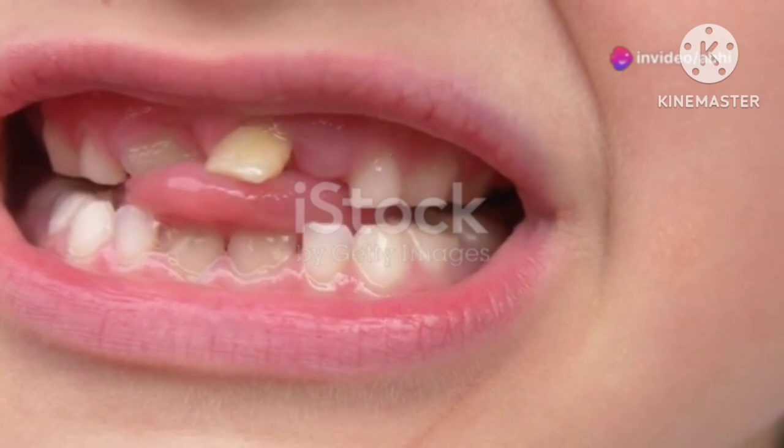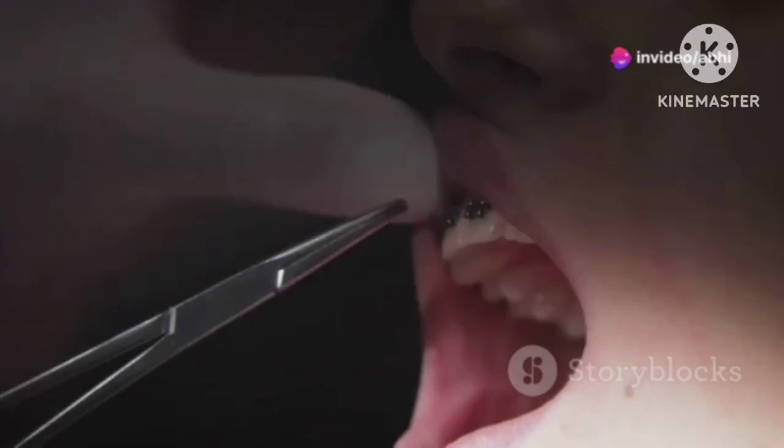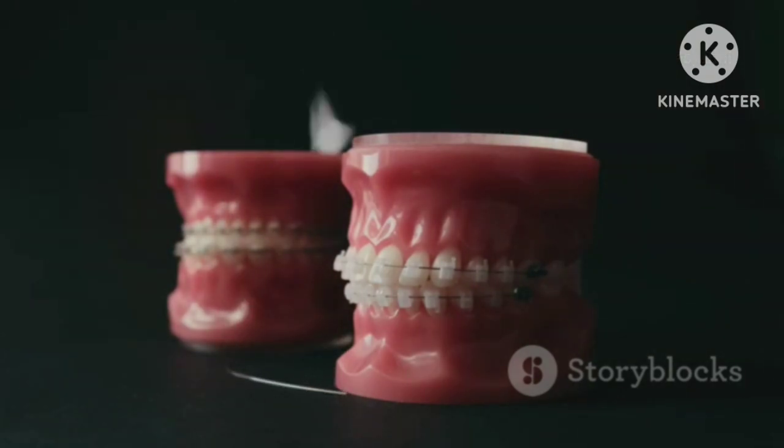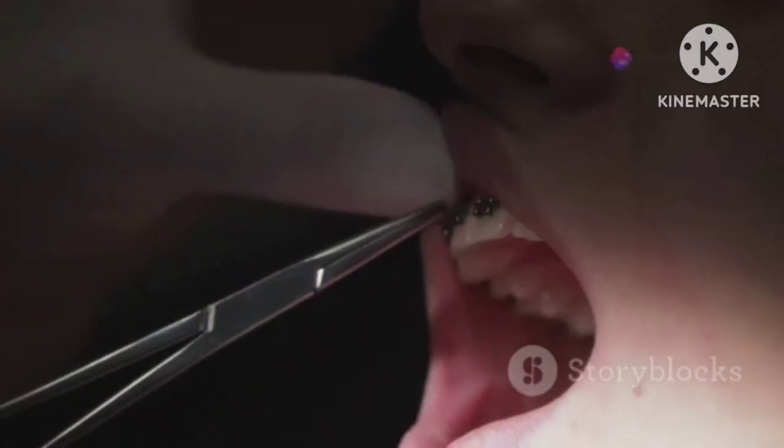If your tooth feels like it's doing the cha-cha, it's time to get steady with wire splinting. Loose teeth can be a real pain, but wire splinting is here to save the day. First, your dentist will clean the area around the loose teeth.